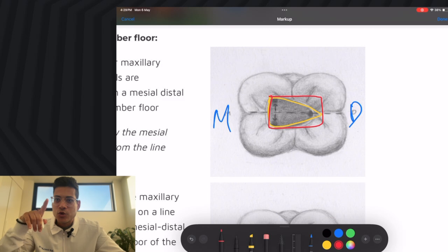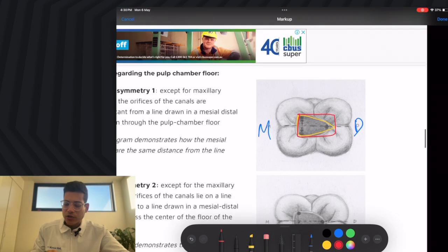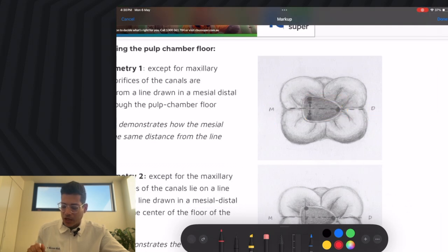That's where I say you don't worry about how the tooth looks, you follow where the tooth is guiding you, keeping the same formula in your mind: straight line axis. Follow the principle that I've made, and do not fall into the social media trap. Make sure you have no roof present, following the outline of the tooth wherever the canal is taking you. If I go back and see, you'll notice in the ADC exam you might get two canals, just one here, one here. Or maybe the mesiobuccal and mesiolingual are so joined together, it's literally like this.